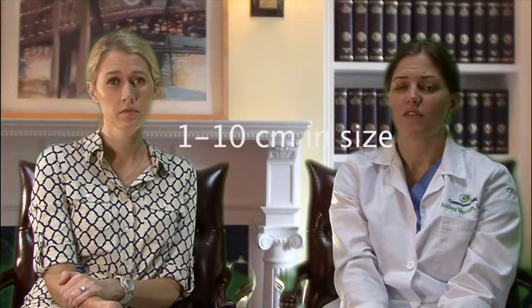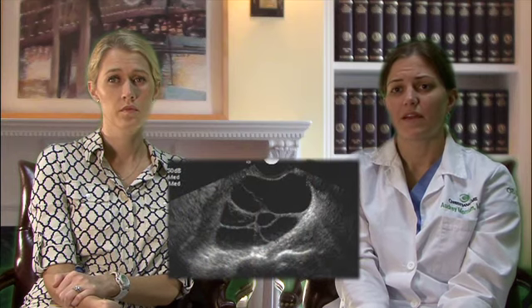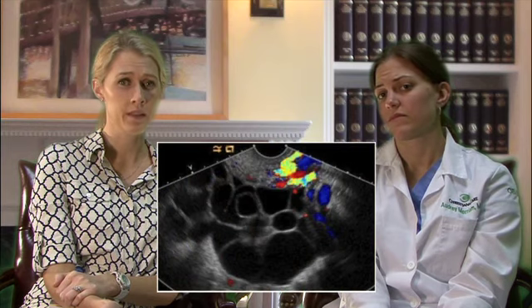Theca-lutein cysts are the last and least common type of functional cysts. Unlike the others, they are almost always bilateral. They form from excessive gonadotropin production, with individual cysts ranging from 1 centimeter up to 10 centimeters. Ovaries can have moderate to massive enlargement due to theca-lutein cysts, and approximately 50% of all molar pregnancies will have them. They are also commonly seen with twins and ovulation induction medications. These ovaries look much larger with many more cysts, but are still considered normal. Always check the other ovary, as they are most often bilateral.